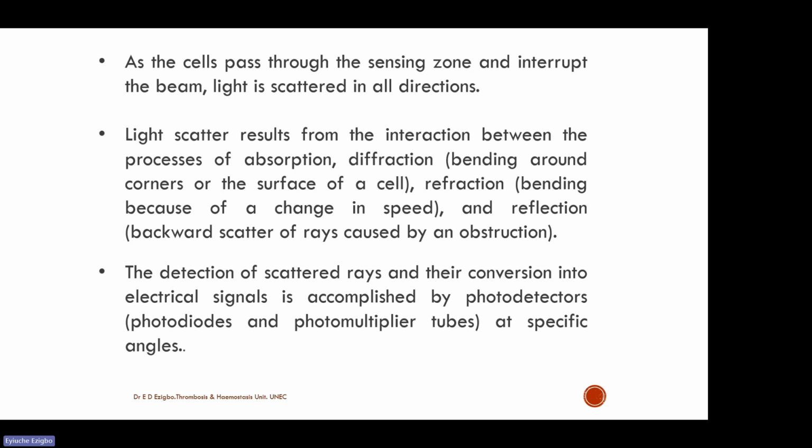The detection of scattered rays and their conversion into electrical signals is accomplished by photodetectors, photodiode and photo, all these things are electrical terms, please.